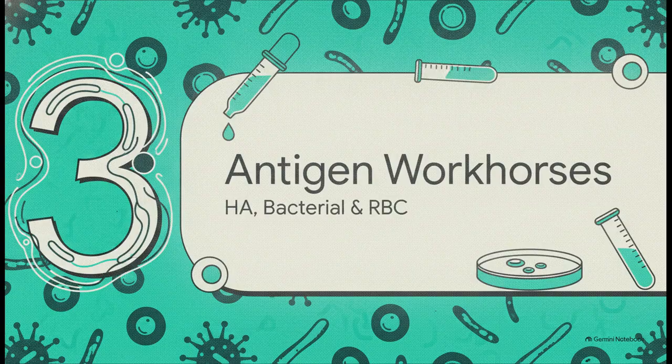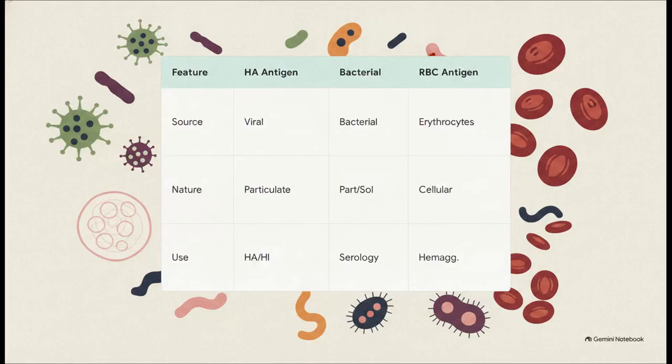All right, part 3, 3 antigen workhorses. Let's look at the tools of the trade. Diagnostic laboratories rely heavily on 3 primary biological tools every single day. First, HA antigens. These are viral or particulate preparations, things like influenza or Newcastle disease virus, and they're used primarily for hemagglutination tests. Second, bacterial antigens. These can be particulate whole cells or soluble components, used a ton in agglutination and serology.